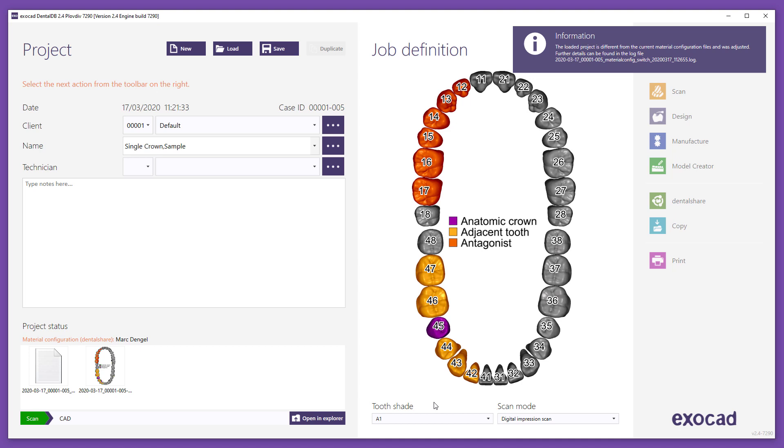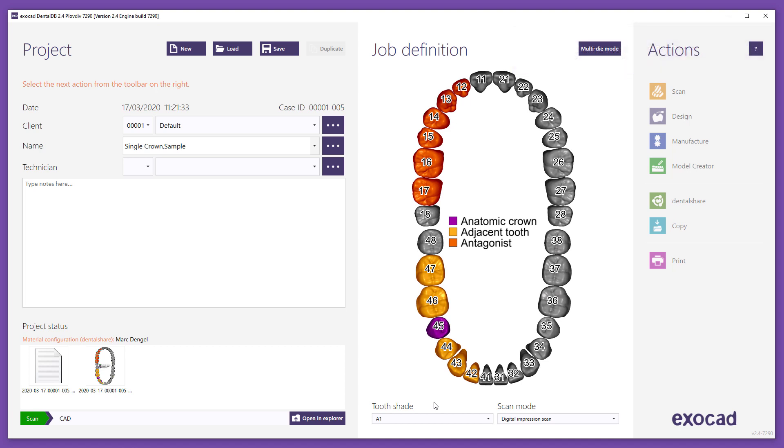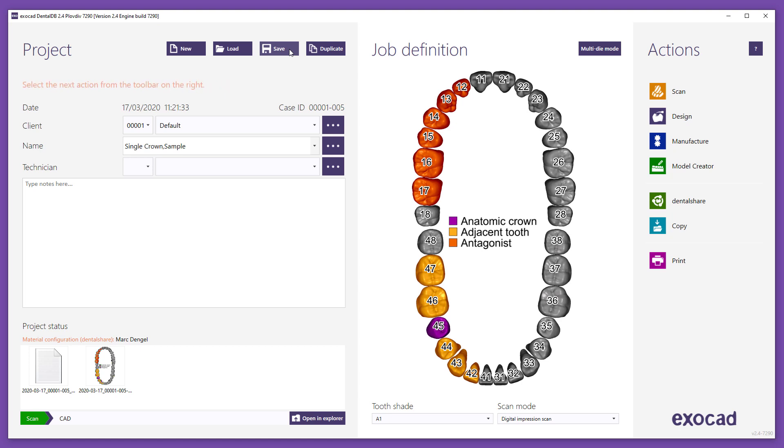If the loaded project has a different material configuration from the chosen manufacturing partner, the project gets adjusted and a log file with the details will appear in the project status window. Note, the correct material settings must be selected before doing the design.